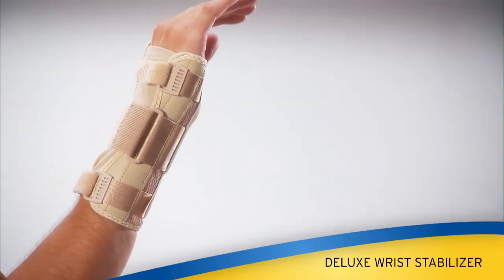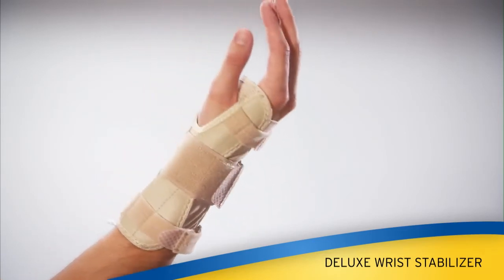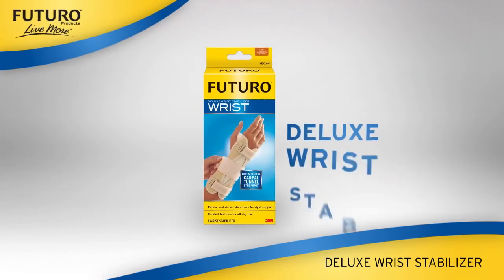This product is made to be comfortable with breathable materials, gel in the palm, and very supportive.